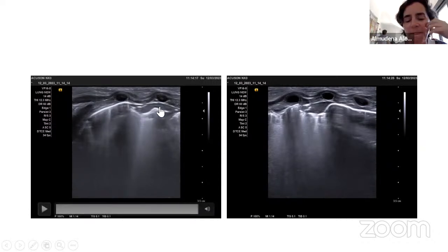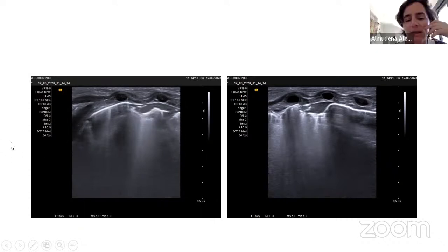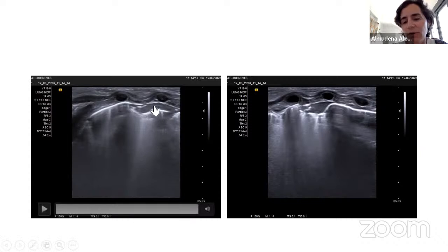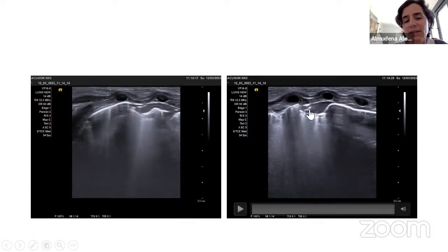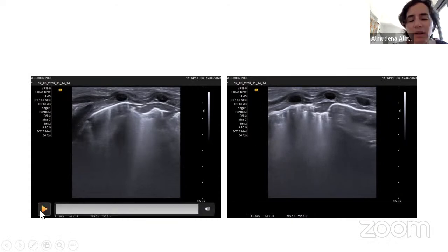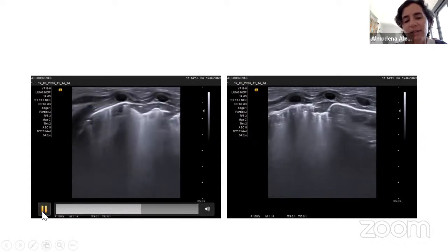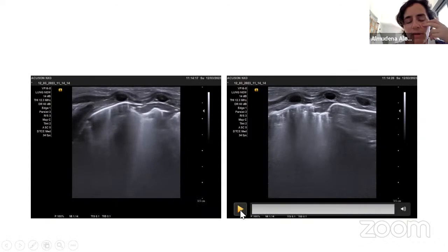Yeah, that's very usual. And do you think that if we could put a Doppler here, it would help? Well, not really, because you're not seeing anything inside. You're just watching the lung collapse there. That's an atelectasis. Probably you won't see anything at all. However, in neonates, the point of having a static or a moving bronchogram, or different organization in Doppler exams, is not that validated as in adult or children references. So it's not that useful, really.